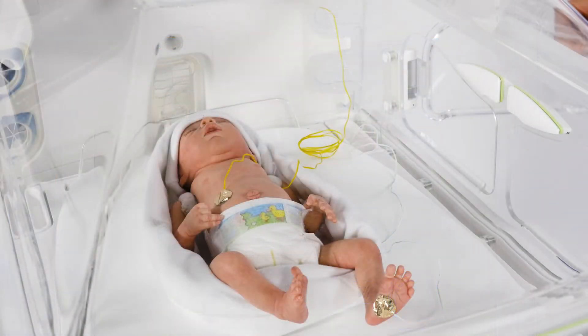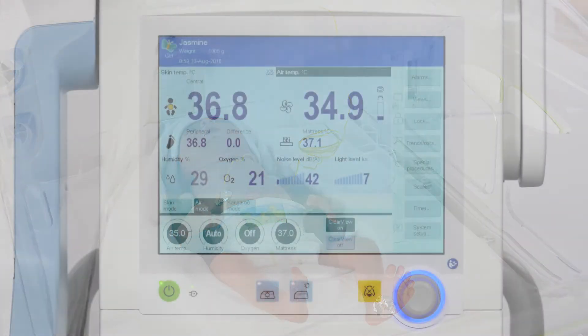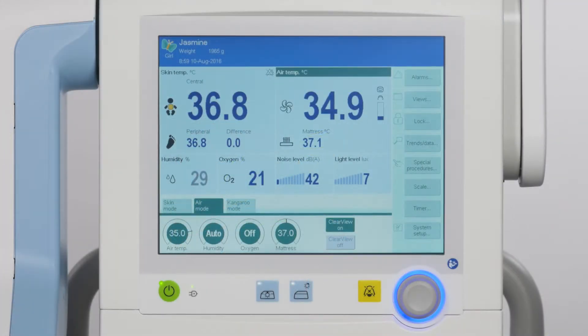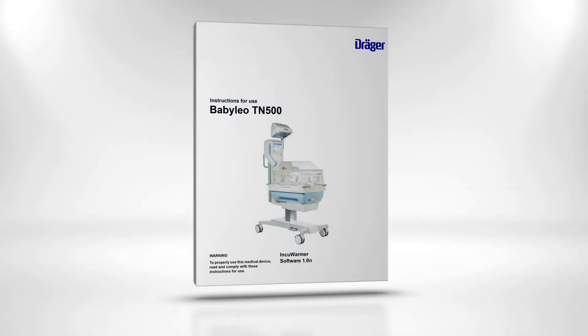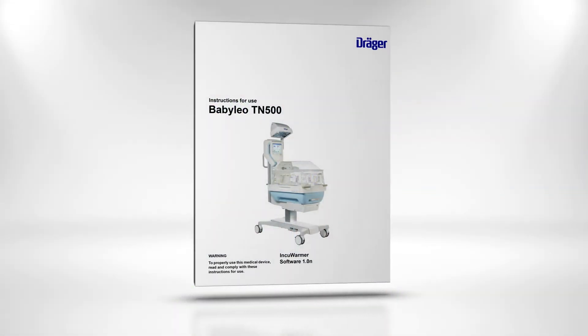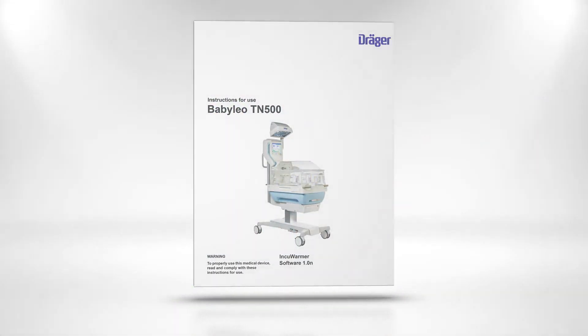The suggested air temperature range is based on the assumption that the patient is a naked patient, clear view is on, and humidity is set to auto. For further information, please refer to the instructions for use.